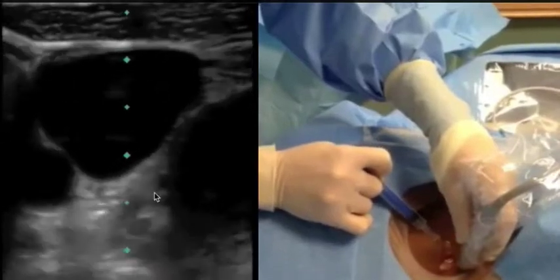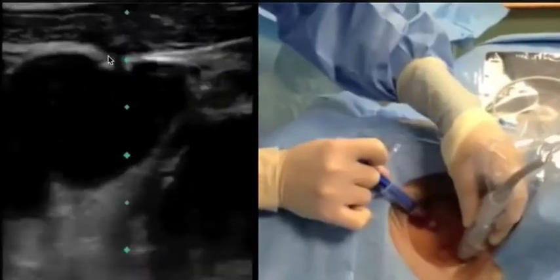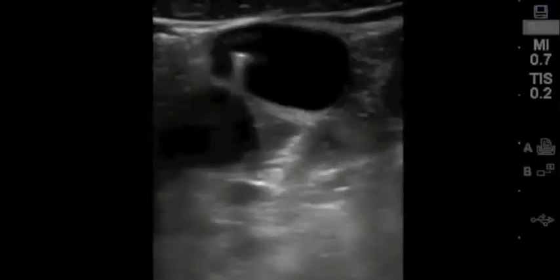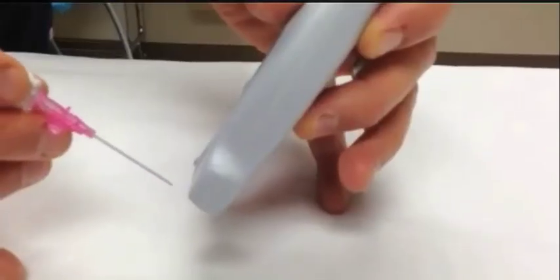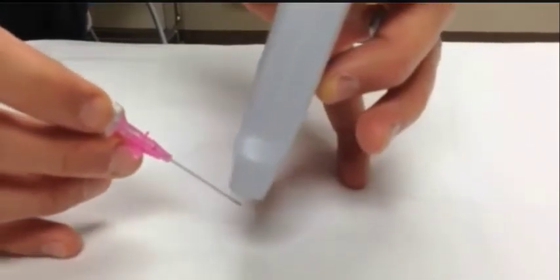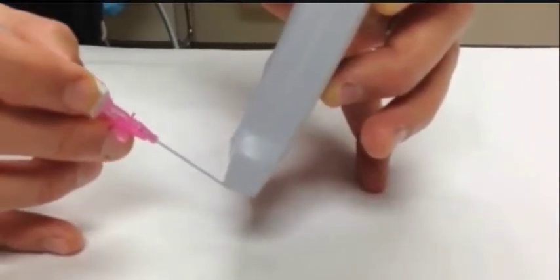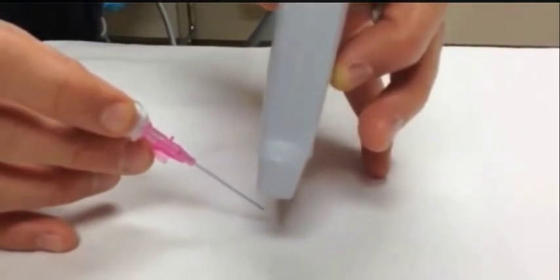This is not the best visualization of the needle tip, but you can see it here pop through the superficial wall of the IJ. Ideally, you would want to see the needle much better and have it show up much brighter and hyper-echoic as in this example. The most important mistake to avoid is losing the needle tip and allowing it to get ahead of the probe. Instead, the ultrasound beam should follow the tip perfectly. One way to do this is with small movements, always keeping the ultrasound just ahead of the needle and stopping the insertion of the needle as soon as you visualize the needle tip. Once visualized, then move the ultrasound probe ahead. This is slightly tedious, but a good way to start when you don't have as much experience.